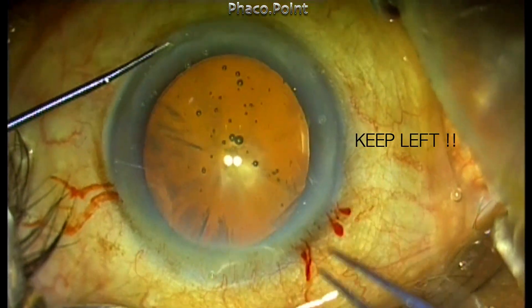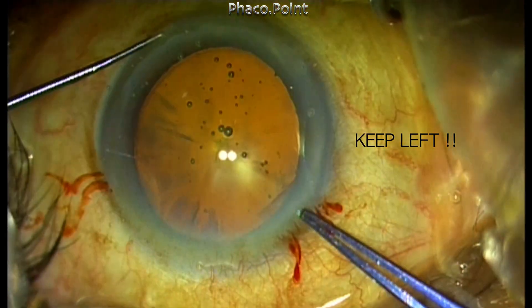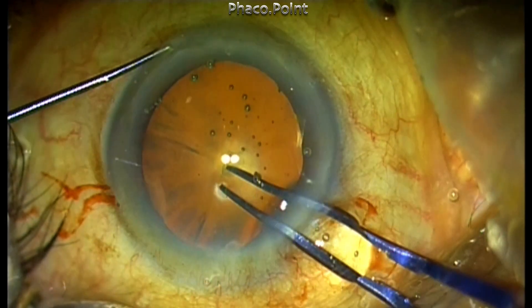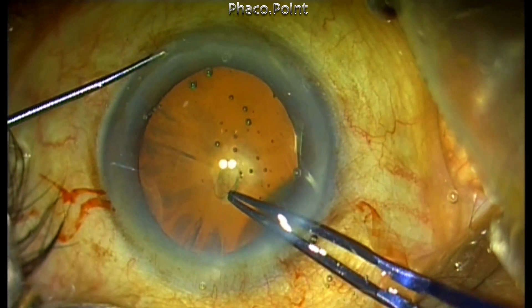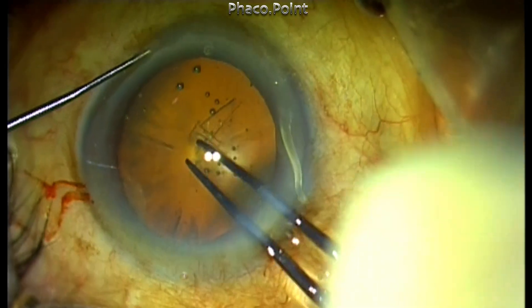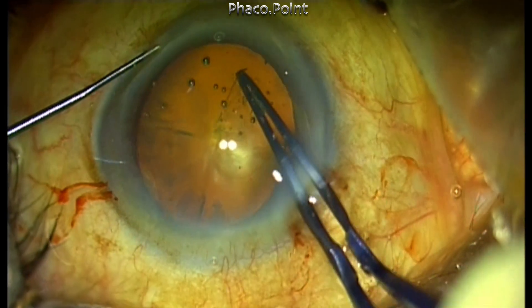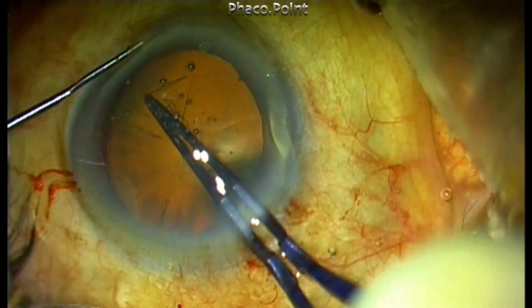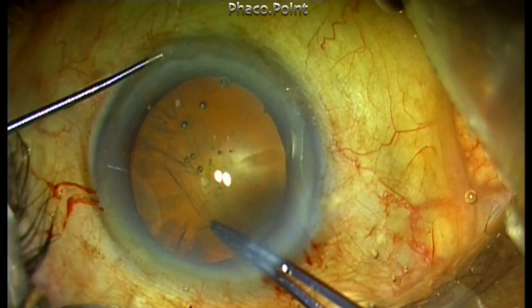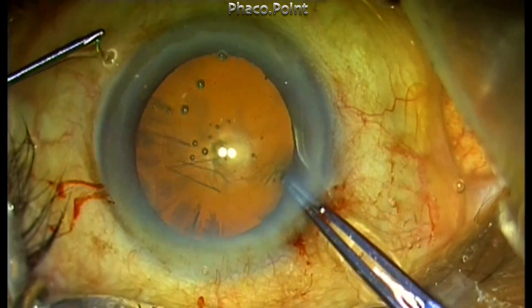Instead, what I suggest is you create the tear from the left, and the first thing you do is finish the sub-incisional area of the tear. This will save you a lot of problems later on with respect to these folds slipping out of the incision and creating problems during the surgery.